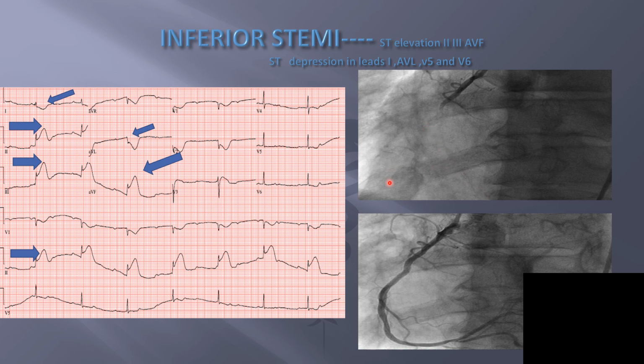After we opened the vessel with the drug-eluting stent, you can see here the stent, kind of right in this area. We got good flow and reperfusion after the cardiac cath.